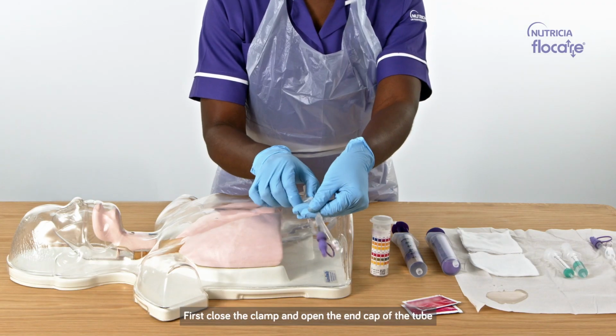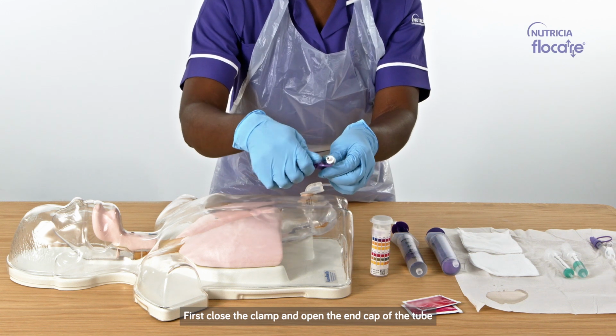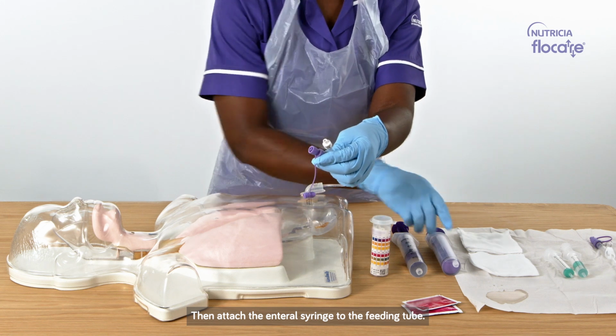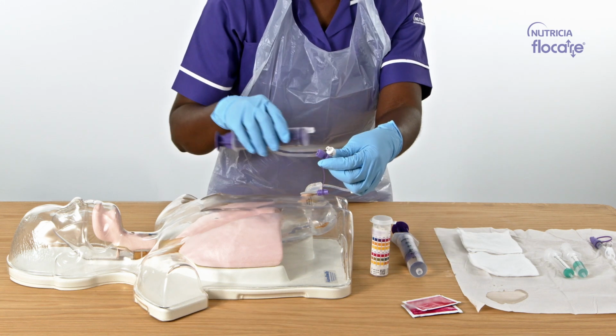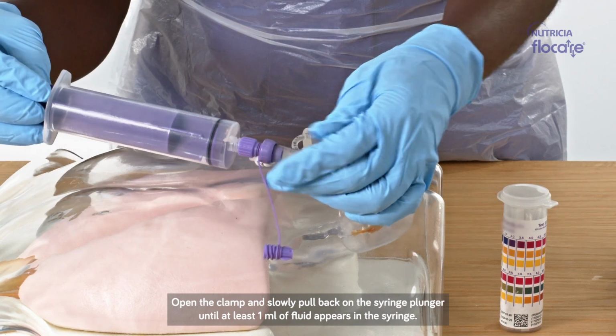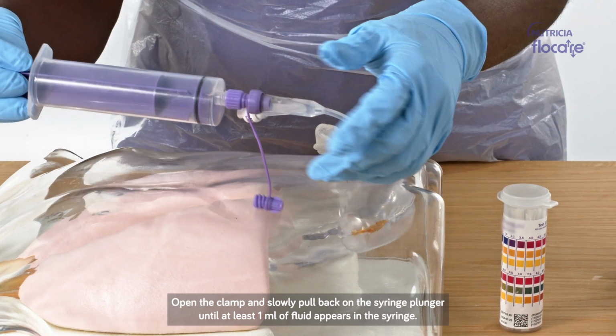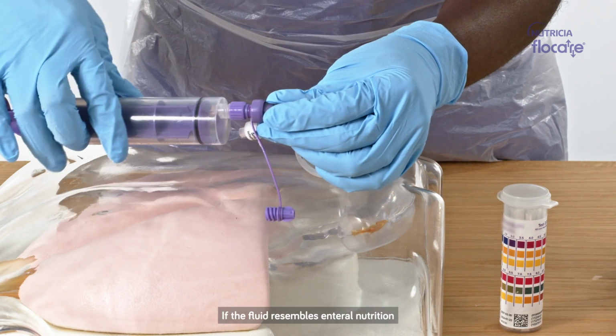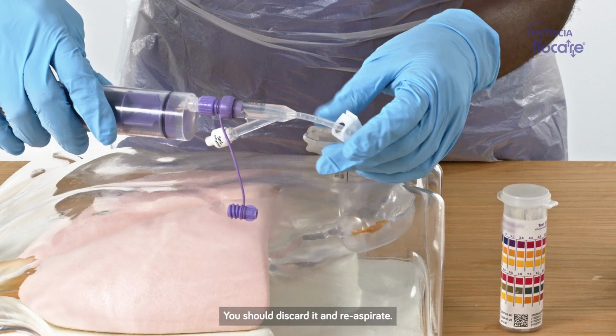First, close the clamp and open the end cap of the tube. Then, attach the enteral syringe to the feeding tube. Open the clamp and slowly pull back on the syringe plunger until at least 1 ml of fluid appears in the syringe. If the fluid resembles enteral nutrition, you should discard it and re-aspirate.